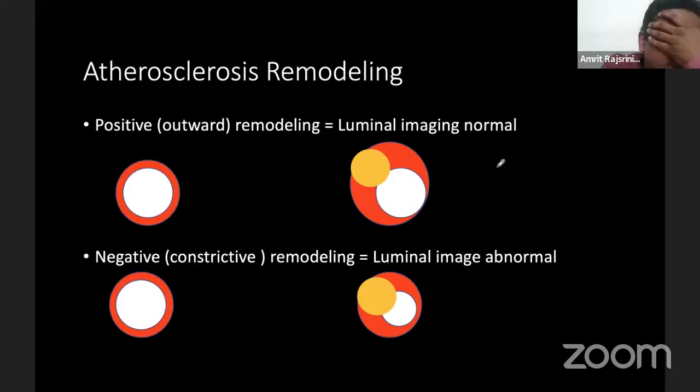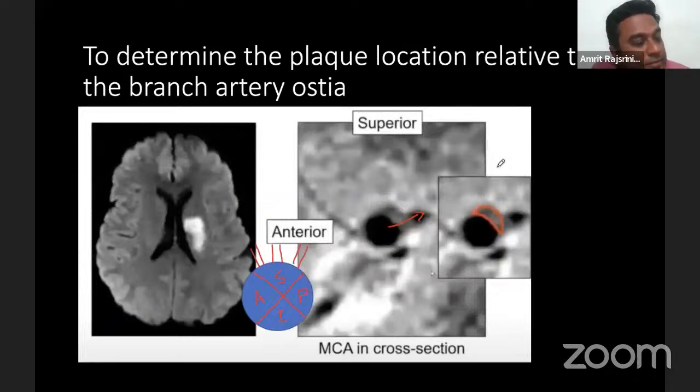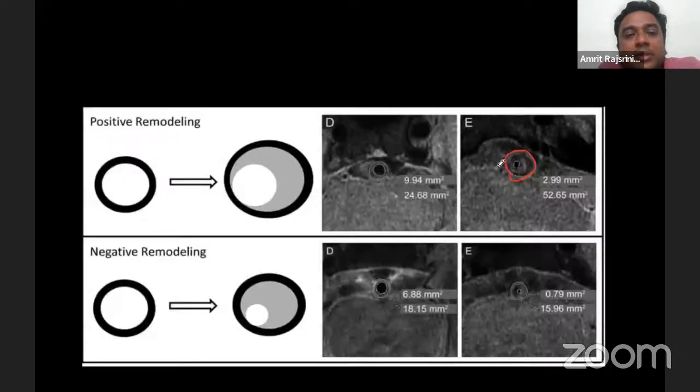As you showed me one case where there's a bifurcation T1 hyperintensity. Normally, whatever is at the bifurcation is usually a clot, right? ICAD, vasculitis are very uncommon there. Whenever the bifurcation is involved, we tend to say it is not intracranial atherosclerotic disease, at least in the MCA. Similarly, when there is a narrowing involving the terminal ICA and the A1 and M1, generally it's not atherosclerotic.